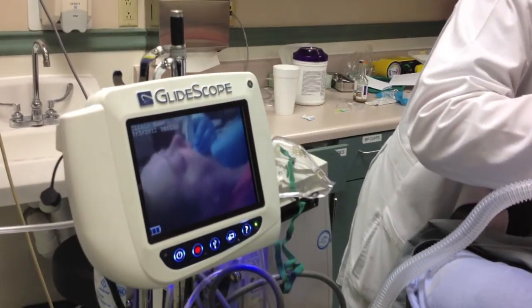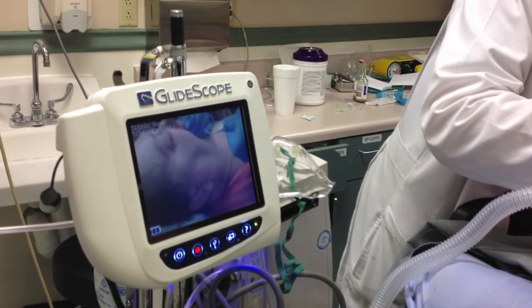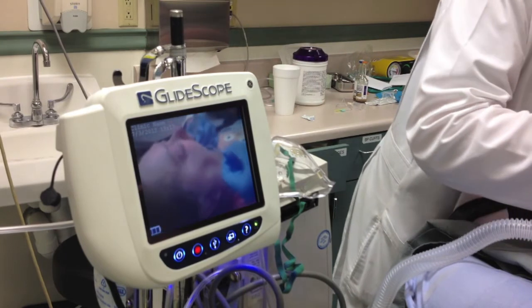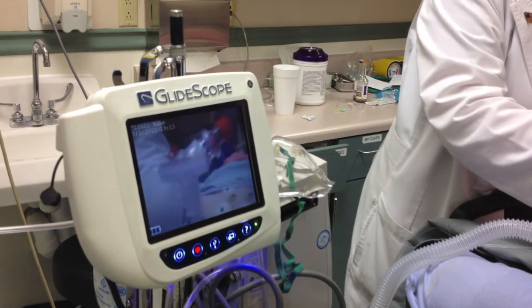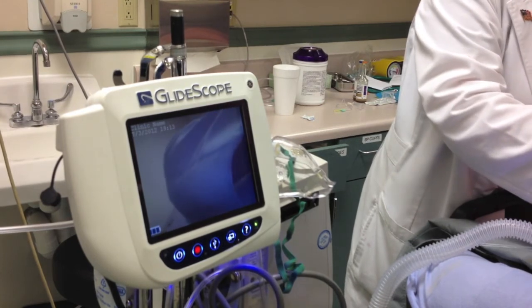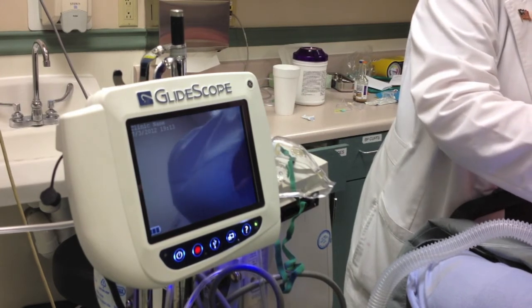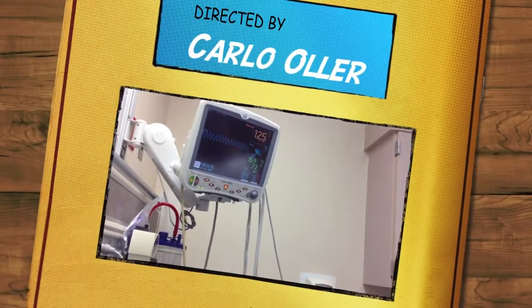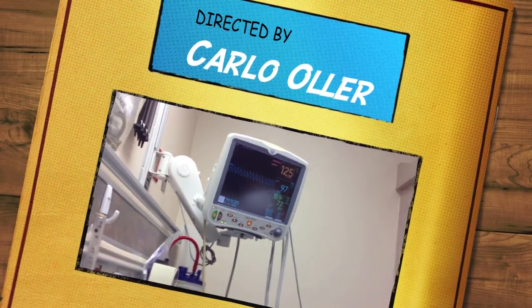At this point, the patient is intubated with an endotracheal tube size 8.0. We're inflating the balloon to prevent movement and create a tight air seal so we can completely control the airway and the amount of air going in. We're also using an end-tidal CO2 detector — a colorimetric test that turns yellow if there's CO2 detected, confirming the tube is in the right place. We auscultate the chest to confirm good aeration, and the oxygen saturation is back to 95–96%. The patient is properly intubated, and of course we'll do an x-ray to confirm.